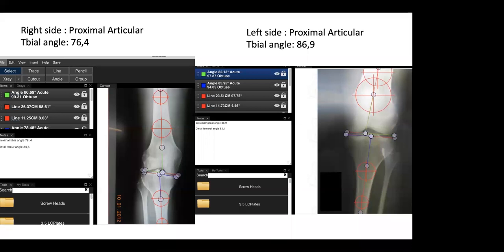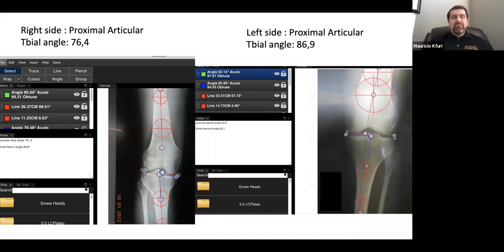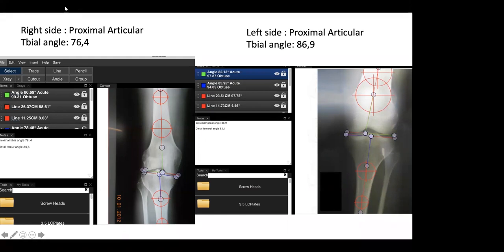Maurizio, due to the proximity of the joint line, do the mechanical and anatomic axes, do you feel like there's a big discrepancy down there? I would say in this particular case there should be some discrepancy. Normally there is a natural deviation of 6 degrees or something like that between one and the other. And this is why I'm saying you can use either method as long as you're familiar with the normal values for each one. Thank you. I agree. Thank you.